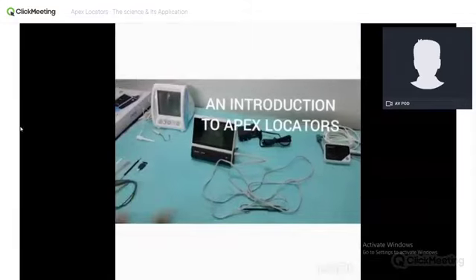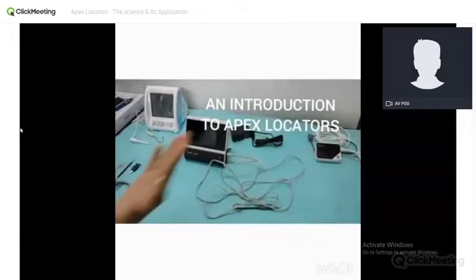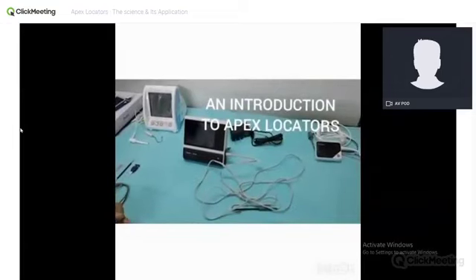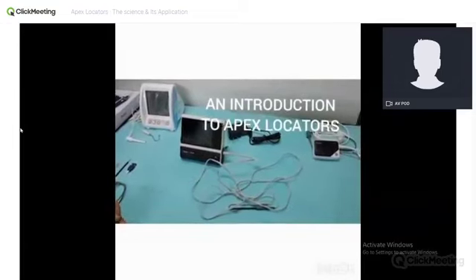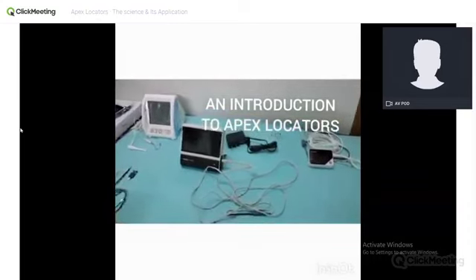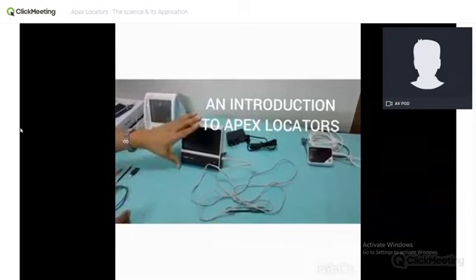Different kinds. They can be compact or they can be tabletop. The benefit of having a compact Apex locator is the advantage of being easy to carry and ideal for a first-time investor cost-wise. Let us see how to operate an Apex locator.